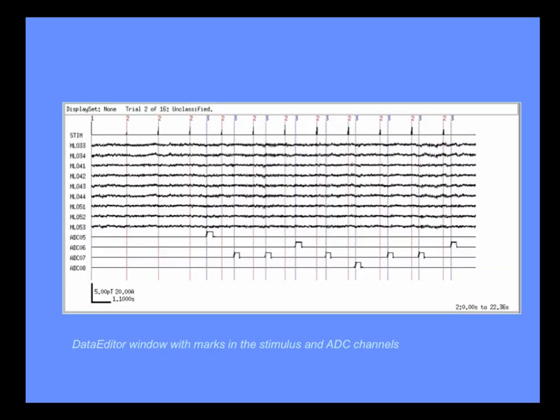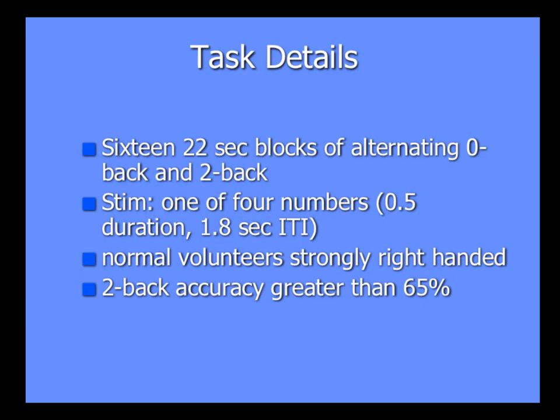So that's the standard quick example of that. The thing you've got to do in the MEG is, in addition to recording the MEG, we record all of the event marks so we know when they occurred in the brain. The subject is pressing a button in response. We record all of those signals so we can parse out what pieces of activity we want to look at by having all of the event marks in the brain.